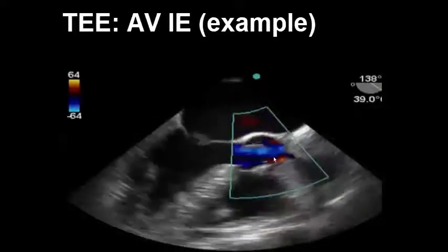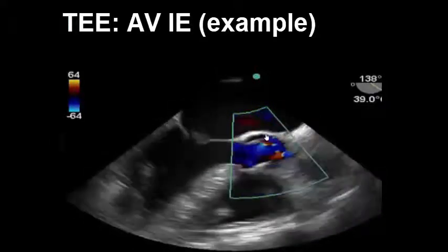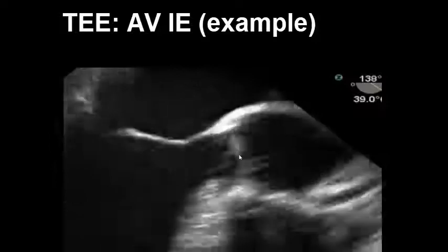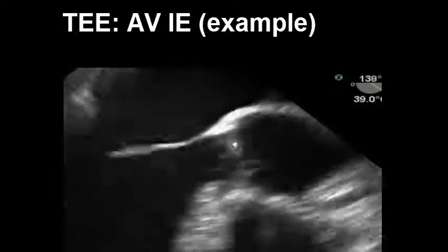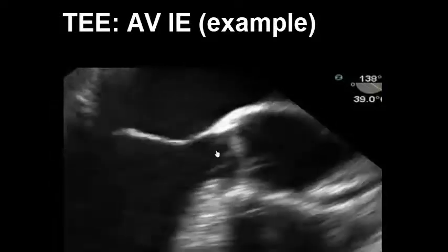We throw color across the aortic valve, and we see evidence of central aortic regurgitation, which is mild in nature. We now zoom in on the aortic valve to have a better look at the non-coronary cusp and its vegetation, which is strand-like in nature, as mentioned before. This particular patient actually had both aortic valve endocarditis and mitral valve endocarditis, seen on formal echoes done by cardiology.